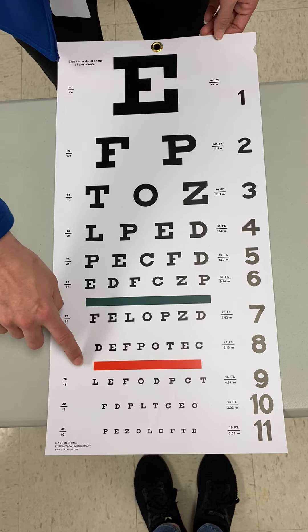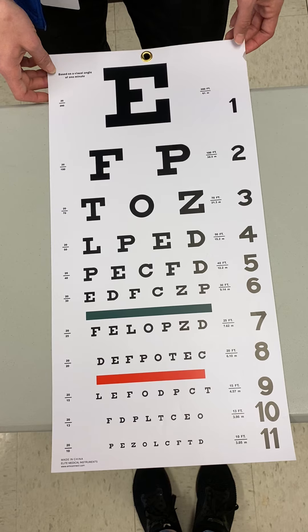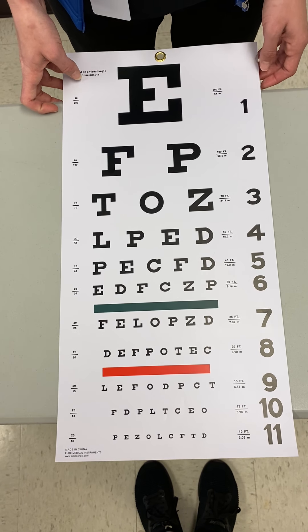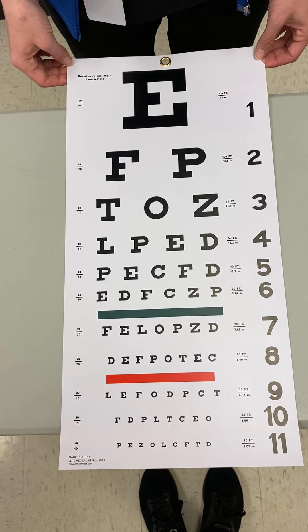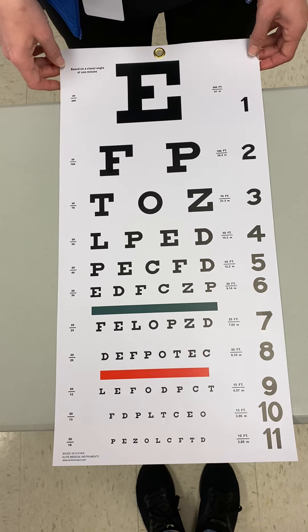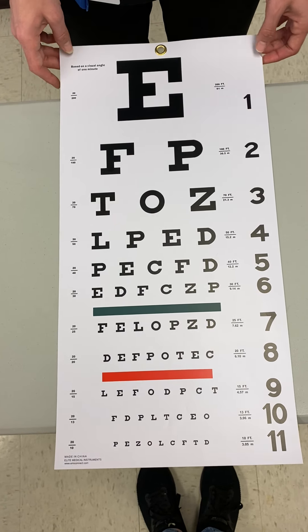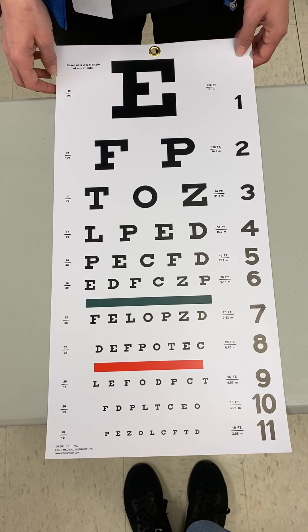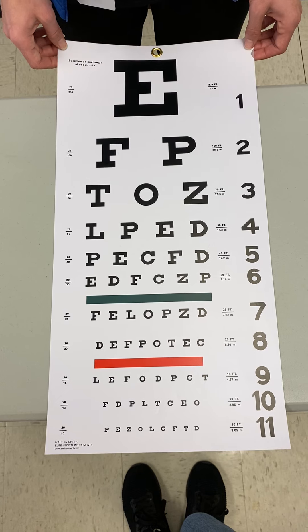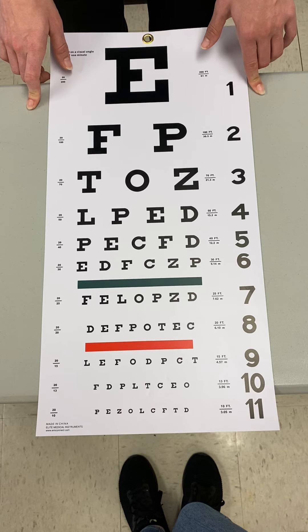On the Snellen chart we also have a green line and a red line, used as a basic screening exam for color vision deficiency. The two most common colors affected are red and green. While performing the eye exam I would ask the patient what color each line is — hopefully they say green and red. If they don't answer correctly, we may need to write a referral to an eye doctor to diagnose their color vision deficiency further.